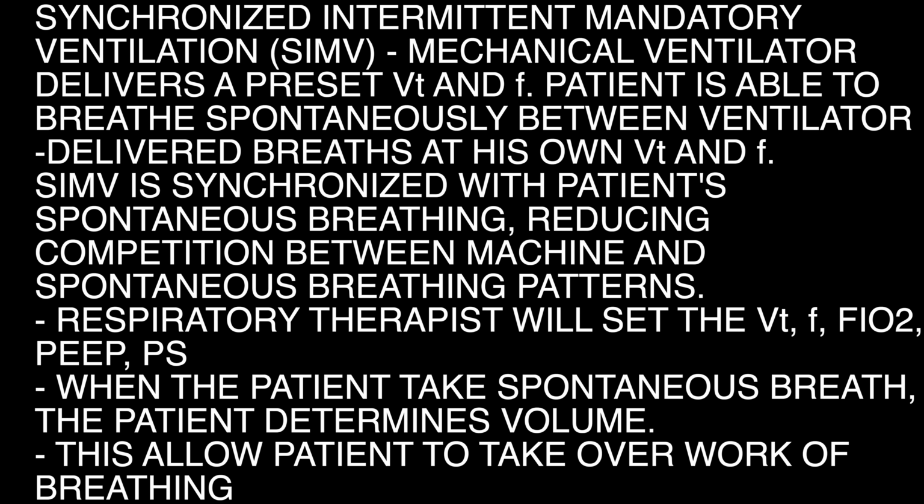Synchronized intermittent mandatory ventilation, SIMV. The mechanical ventilator delivers a preset VT and F. The patient is able to breathe spontaneously between ventilator-delivered breaths at his own VT and F. SIMV is synchronized with the patient's spontaneous breathing, reducing competition between machine and spontaneous breathing patterns.